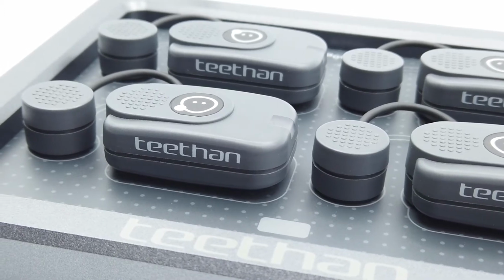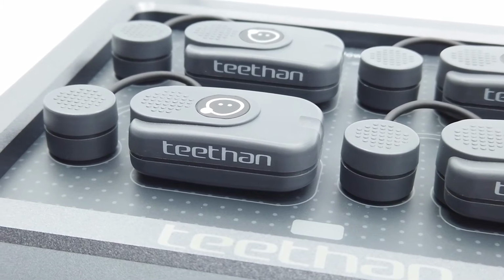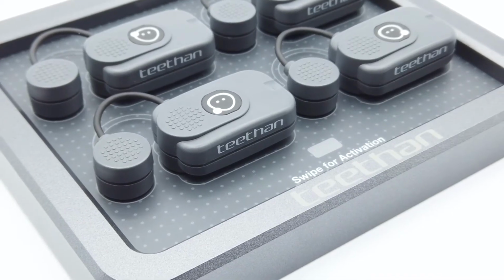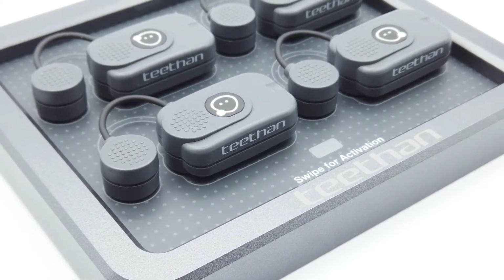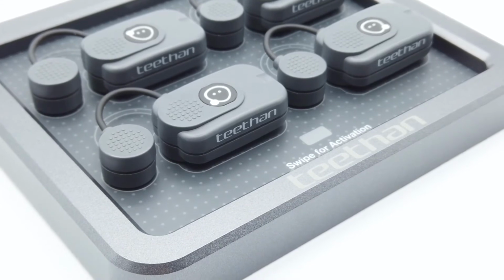The battery status of the probe can be checked in the software after properly connecting the USB receiver and activating the probes. The probes turn off either by swiping them back across the magnet or by placing them all back on the charger when it is connected to the PC or to a power supply.